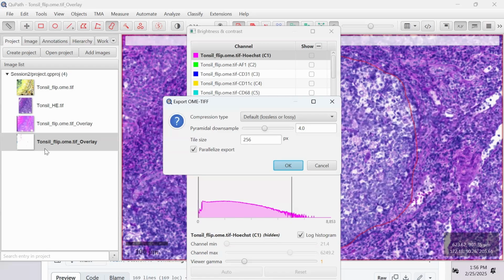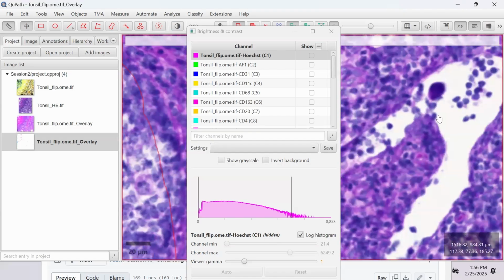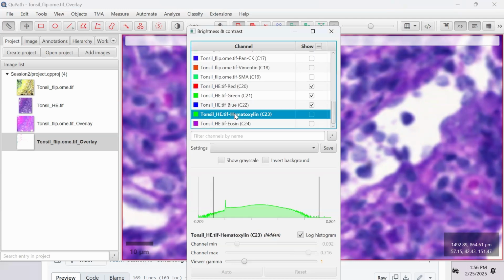So looking at those empty spaces or blood vessels or some structures that are visible in both types of images would be important. But from the perspective of the math, it doesn't actually matter, and the workflow will be very similar. If you have, let's say, PSR fast green staining, you would probably want to separate the PSR and the fast green component so you can have them available as additional channels in your final file. That would make the most sense.